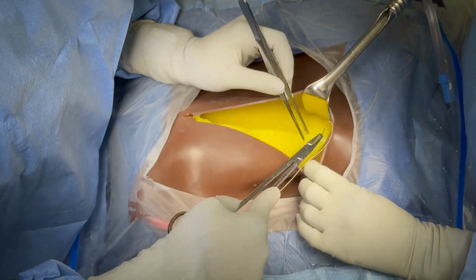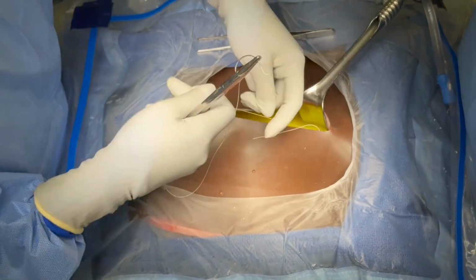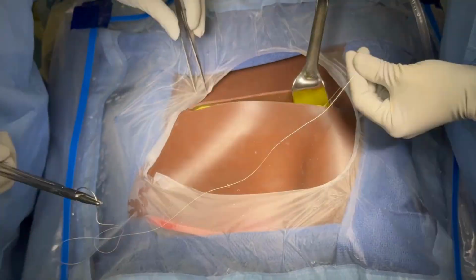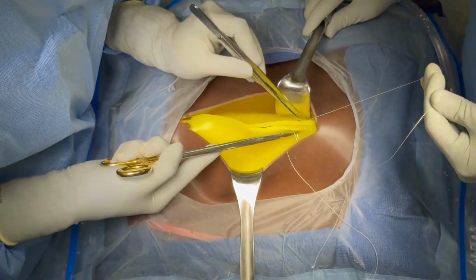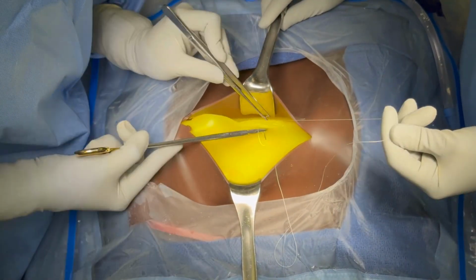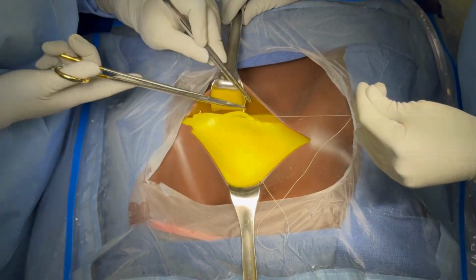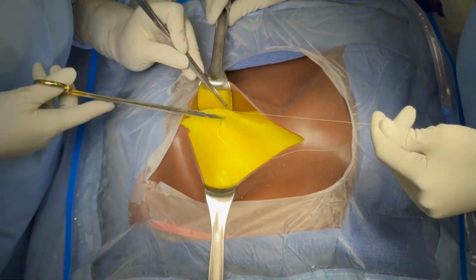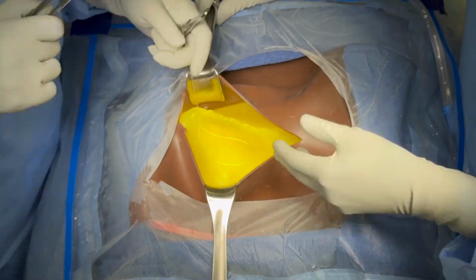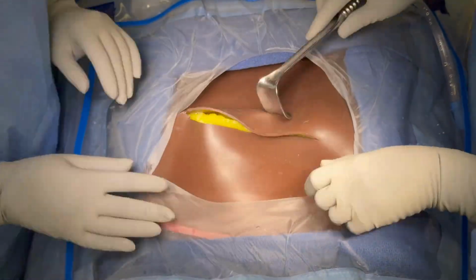A 3-0 Vicryl on a CT1 needle is then used to reapproximate the subcutaneous tissue in a running, non-locked fashion. This step is indicated if subcutaneous tissue has a depth of 2 centimeters or greater, but can be performed at less than 2 centimeters in depth for the purpose of cosmesis or better reapproximation of the incision. If the subcutaneous tissue cannot be well approximated in a one-layer closure, a multi-layer closure may be warranted to eliminate potential dead space and reduce the risk for seroma formation.